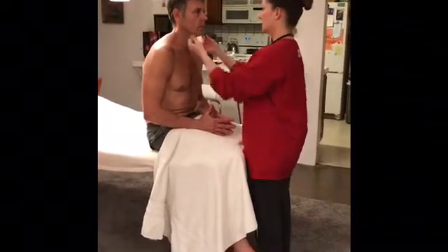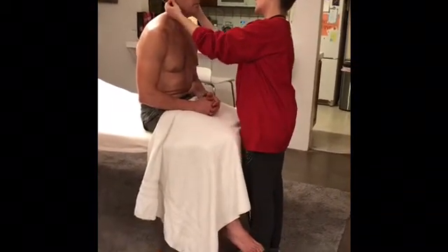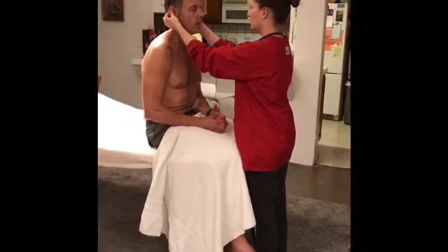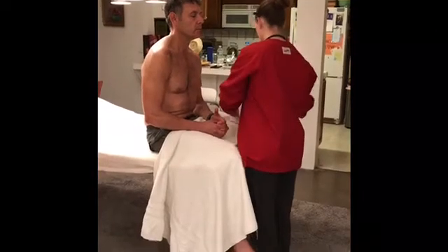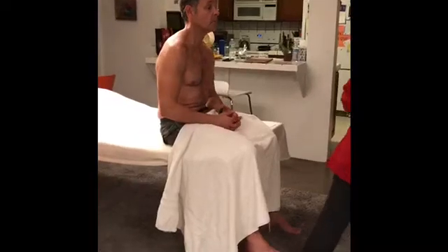So first off, we're going to start to examine the ears by looking at them for any lesions or any sores. Give a little tug on them. Any pain when I tug on your ears at all? Yeah. Great. I'm going to go ahead and do the hearing tests, and then we'll go ahead and look inside your ears.